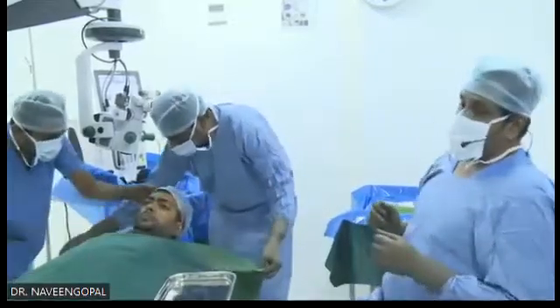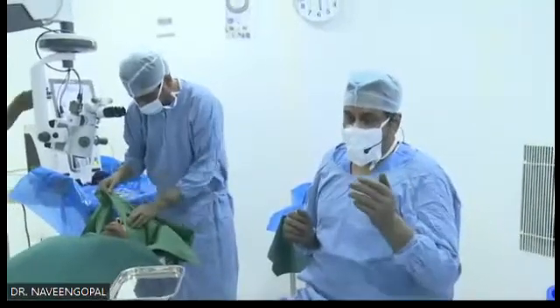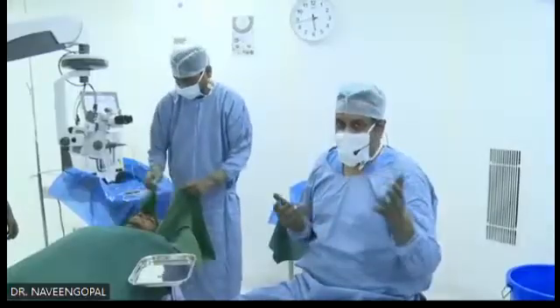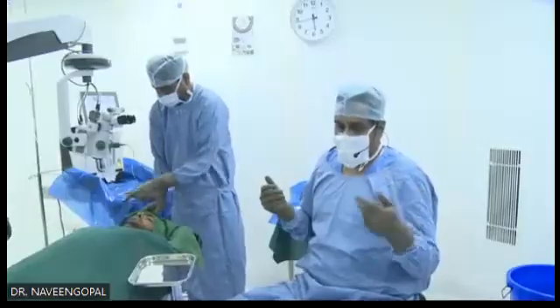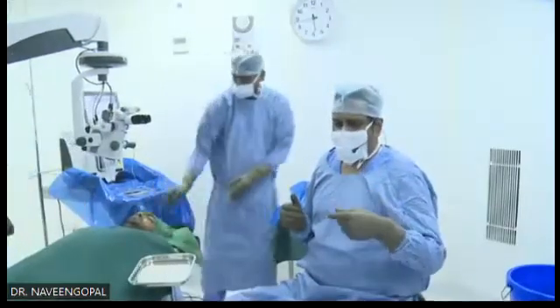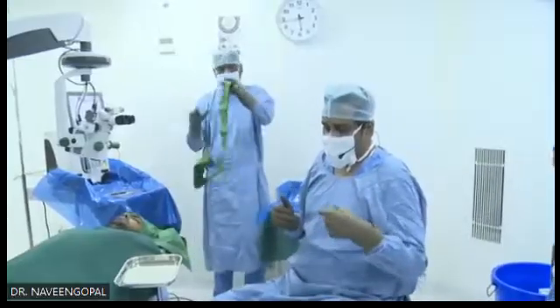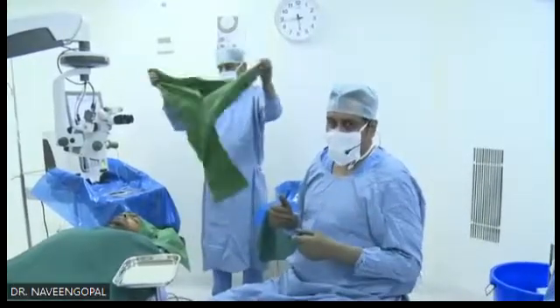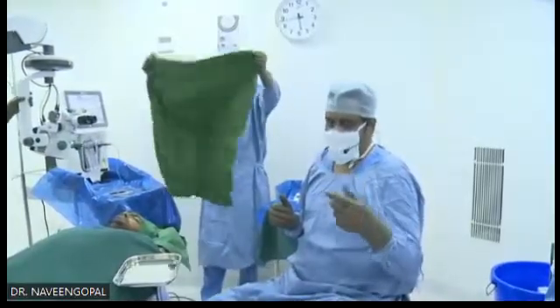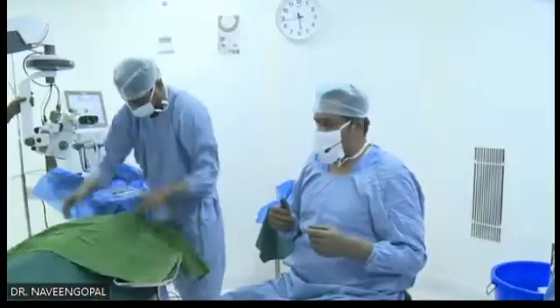One more thing I wanted to tell you is I always prefer to do my ICLs under topical and with a temporal incision. Why? Because obviously the axial length will be more. Any ICL I do will have an axial length of about 26. So if you block the patient, you end up with the danger of penetrating the sclera. So doing topical, be confident, nothing will happen. Use intracameral 1% lignocaine, which is preservative free.